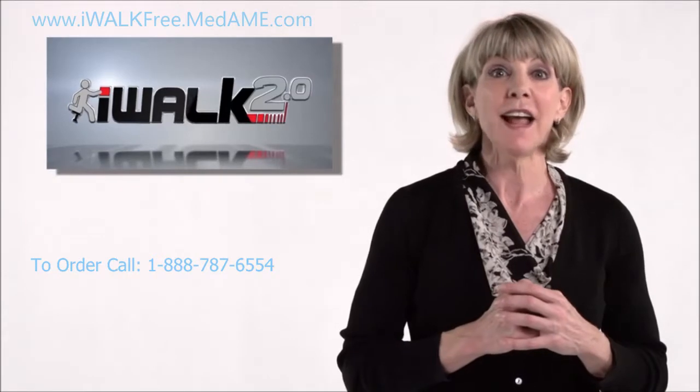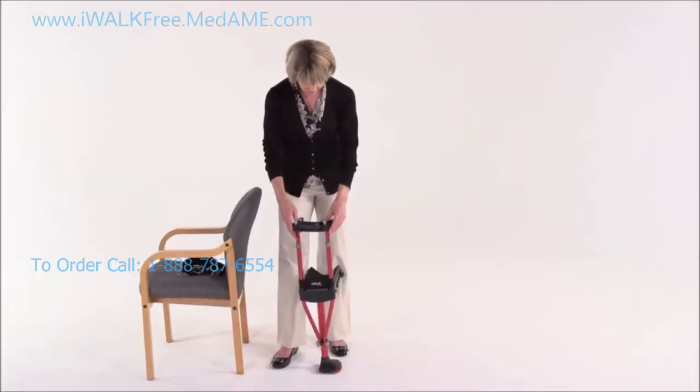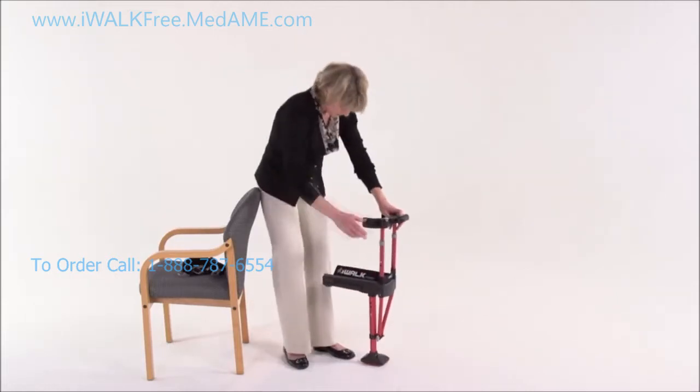Now remove anything from your pockets, pull your pants up at the waist, and let's get started. Once you have the iWalk foot properly aligned, the next step is to adjust the height of the lower section. First, locate the bottom of your kneecap.